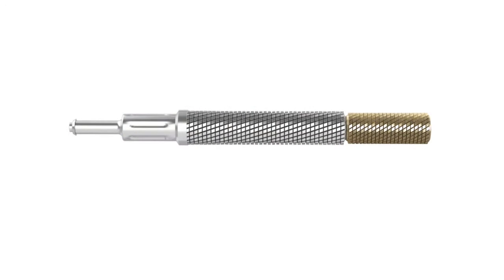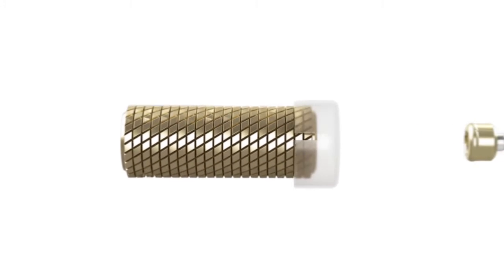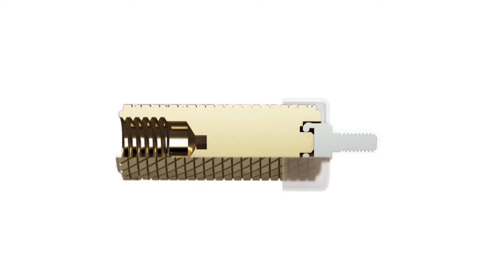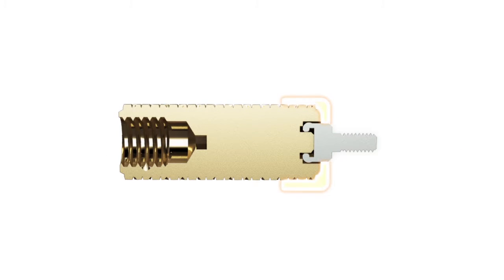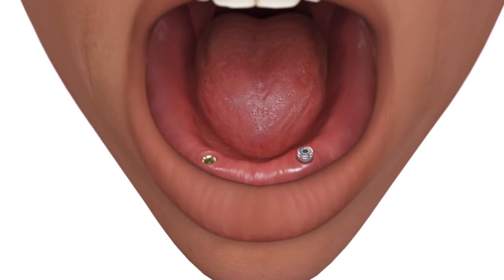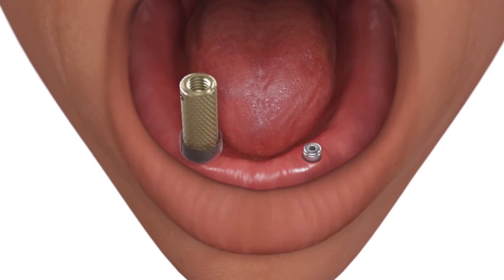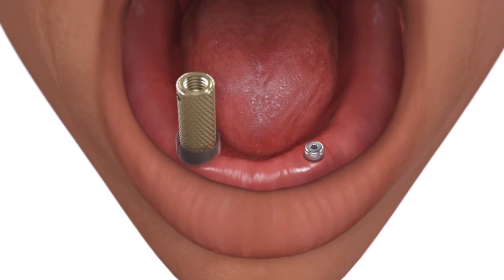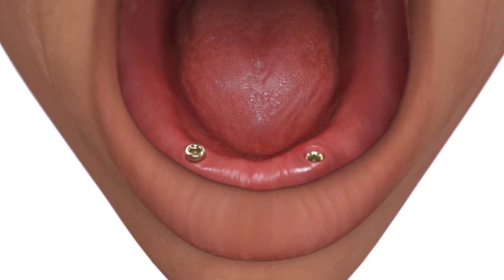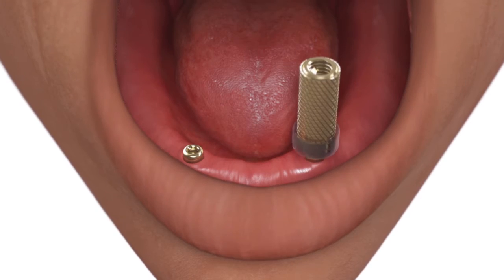Remove the hand driver from the locator core tool. Attach the locator abutment to the hand driver using the locator abutment holder. Place the locator abutment onto the implant body and hand tighten. Place each locator abutment immediately after removing the healing abutment to prevent soft tissue from collapsing over the implant.